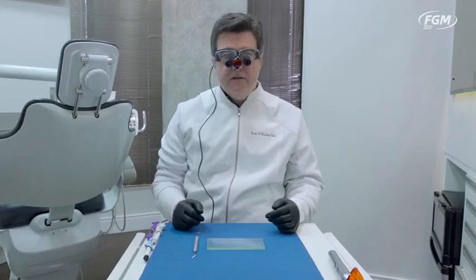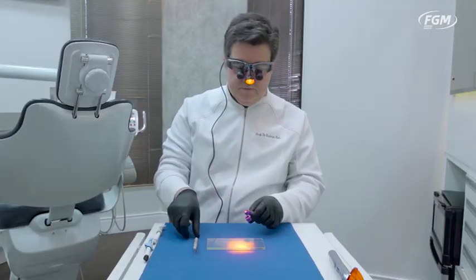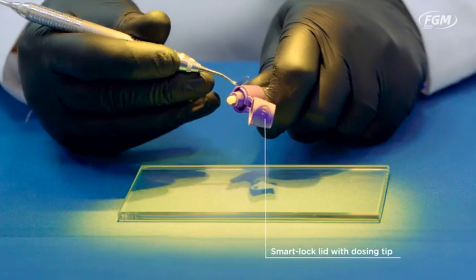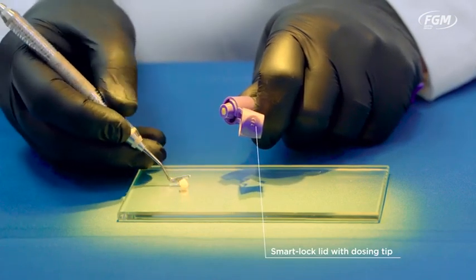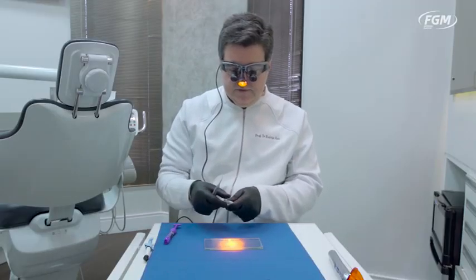Now we're going to demonstrate the effect of the light from my loop on the working time of composites compared to the composite with APS technology, a composite called Vitra. I'm going to turn my light on with the filter and dispense a small amount of composite. We'll try to dispense equal amounts of each brand. This is not actual research — this is just a demonstration in an attempt to replicate what happens in the clinic.